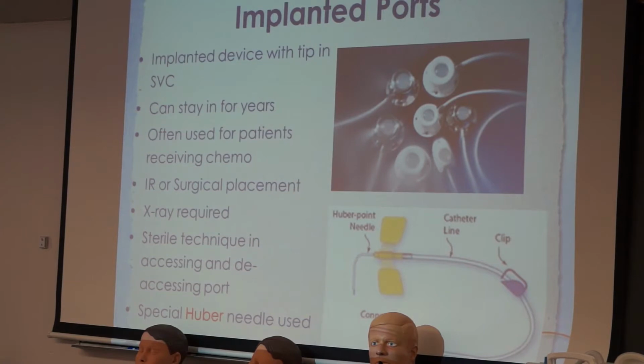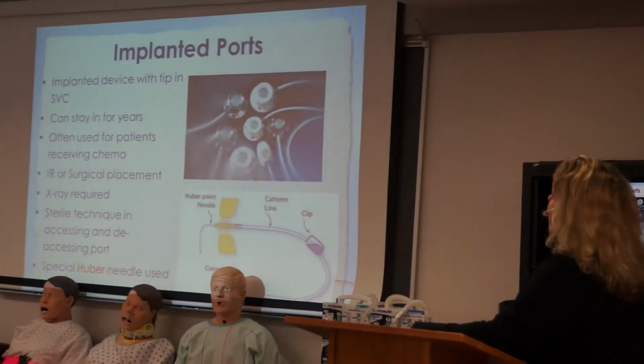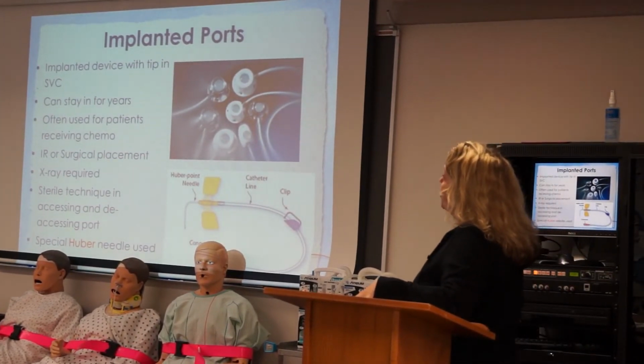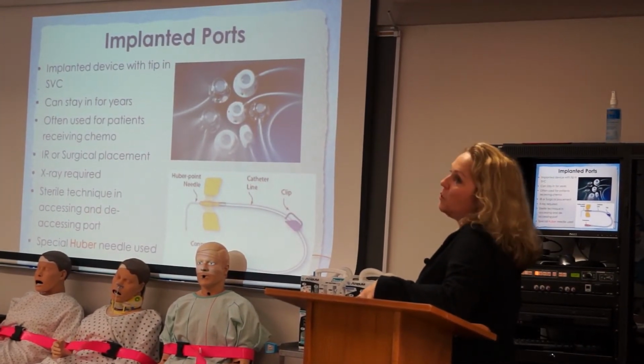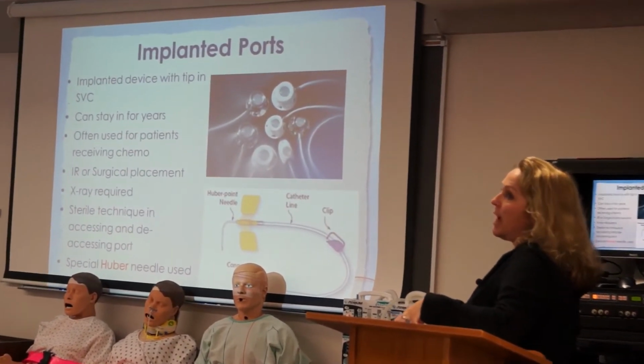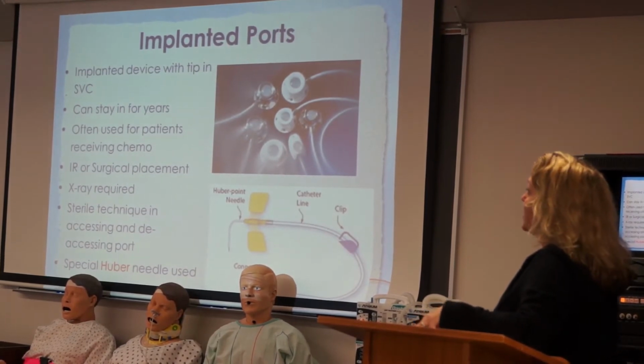So let's talk a little bit about ports. Has anybody seen a port? A couple of you guys? Ports are usually put in interventional radiology. You'll see these mostly in patients who have chemotherapy being performed. My mother-in-law actually just got one of these in. She's getting ready to start chemotherapy this week for breast cancer.